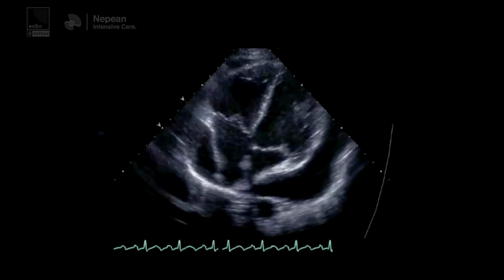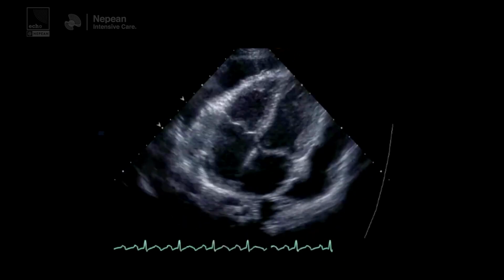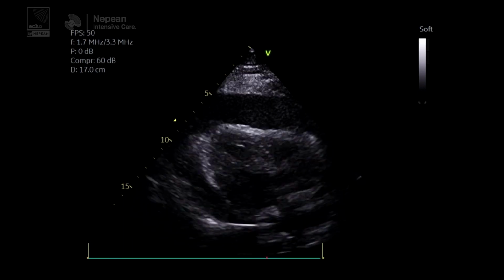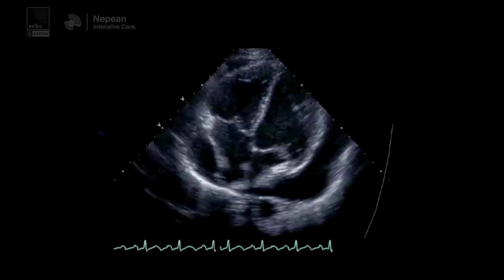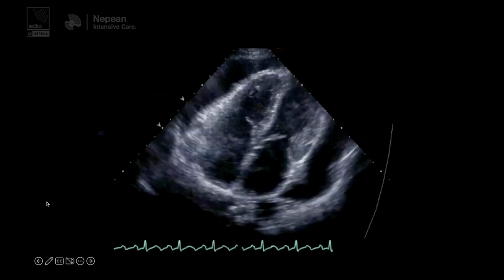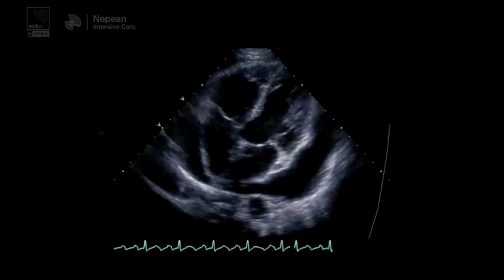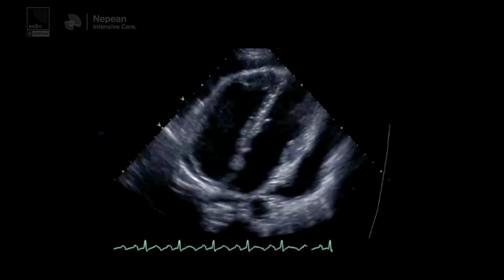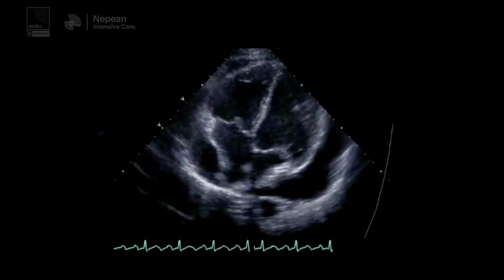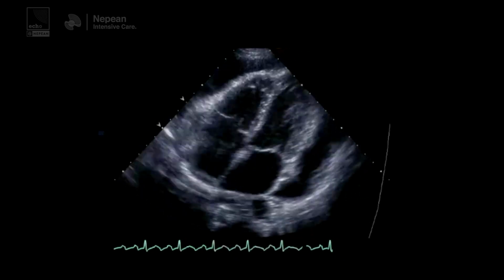And then your right ventricle collapses in diastole. Now, a nice thing with the one we were just on, Chris, is that we've got biatrial collapse, but we don't have any RV collapse. Yeah, which is quite unusual, really. It is, but I don't think it's so unusual in our patient group, I must say, because we often have patients with chronic pulmonary hypertension and chronic RV dysfunction. They're on a ventilator as well.